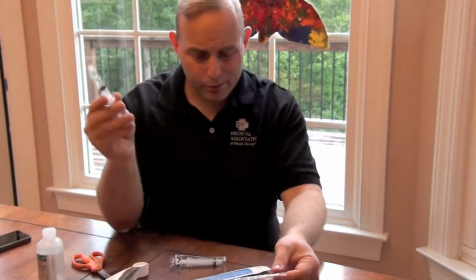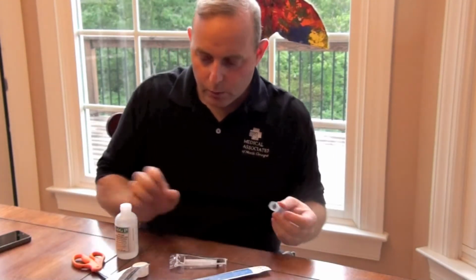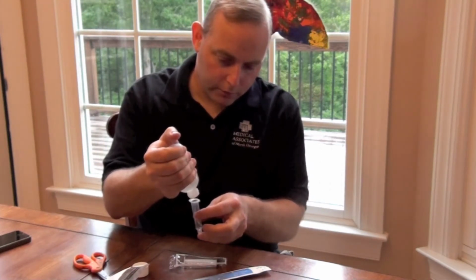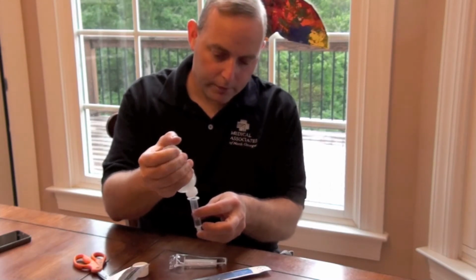This one is prepped. It's got 4 ccs of lidocaine. That's plenty. Same thing with number 2, and this one will be the therapeutic syringe. Same exact volume, same exact medicine.